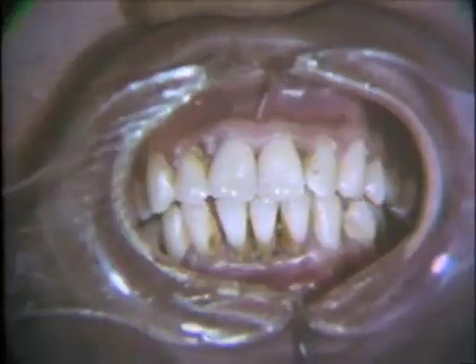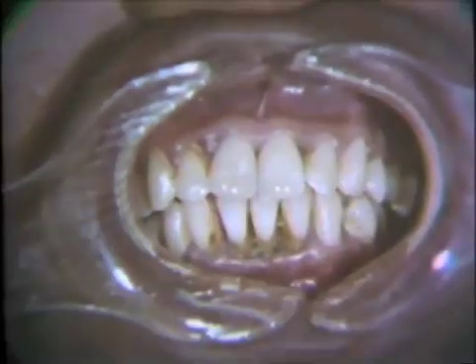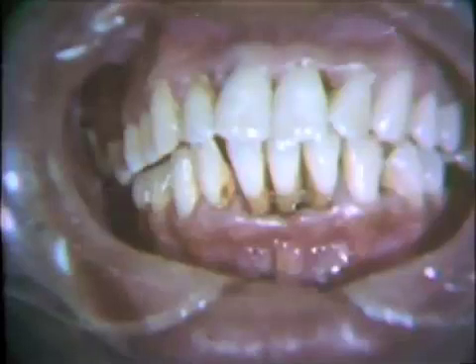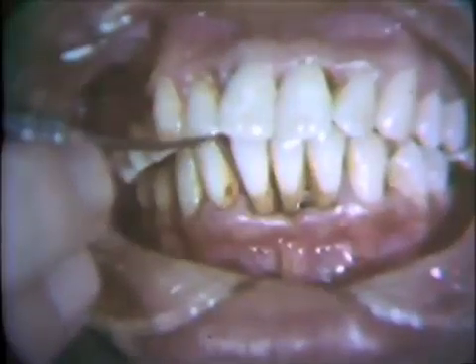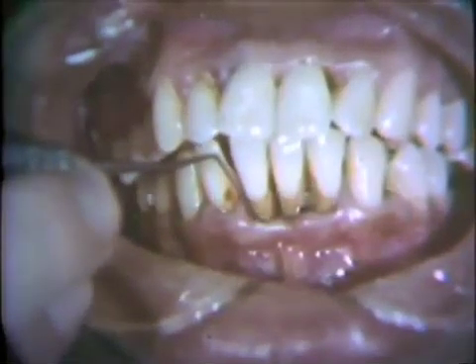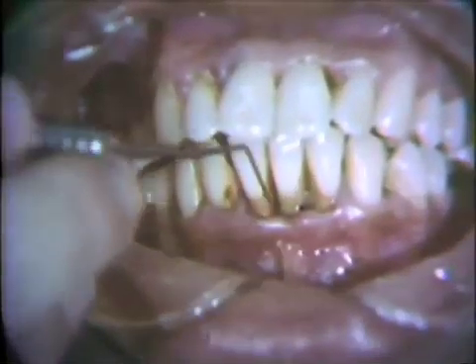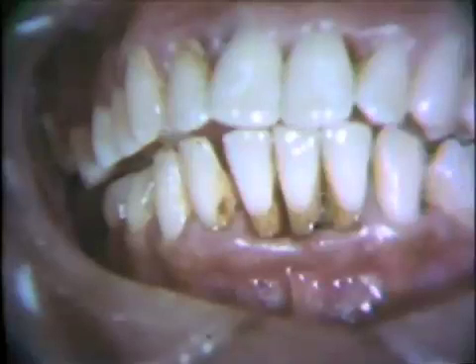This movie will illustrate the procedures to be included in the initial or hygienic phase of all periodontal therapy. The patient has advanced periodontal disease with a bluish-red discoloration of the gingival tissues. Moderate to deep periodontal pockets are present. The periodontal status is indicated on this chart.